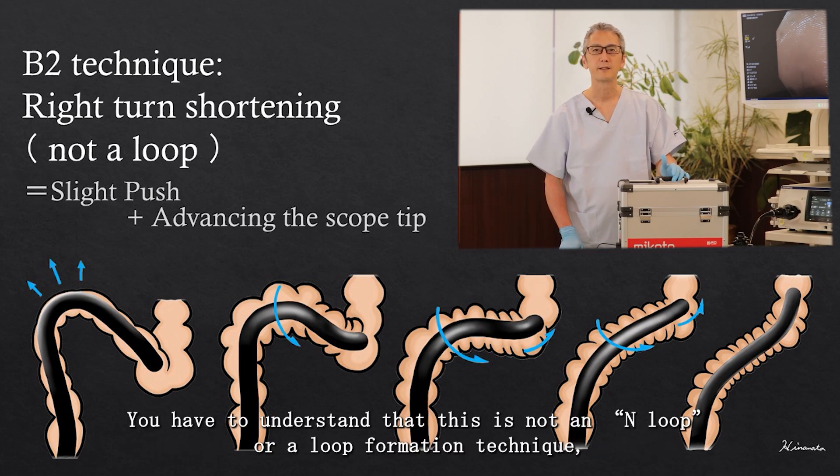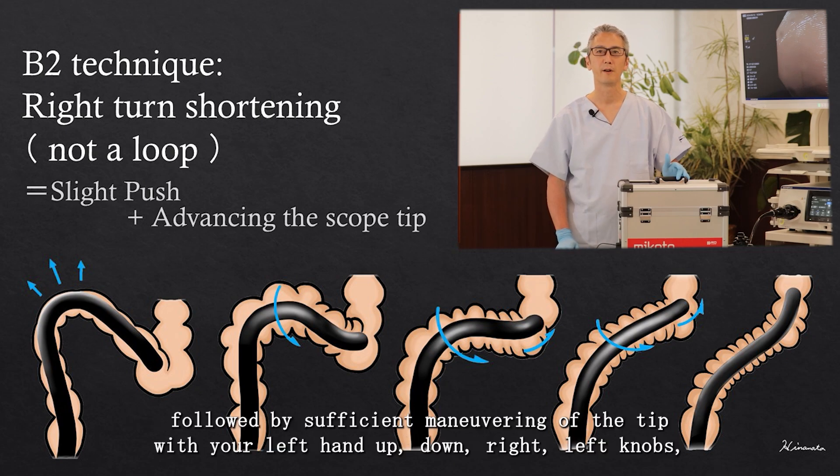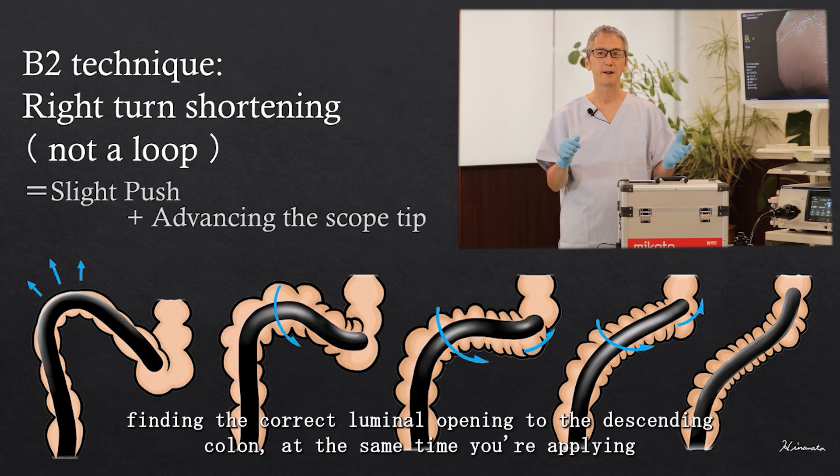You have to understand that this is not an N loop or a loop formation technique, but this is actually a slight push and stretching of the sigmoid colon, followed by sufficient maneuvering of the scope tip with your left hand up, down, right, left knobs, finding the correct lumen opening to the descending colon.